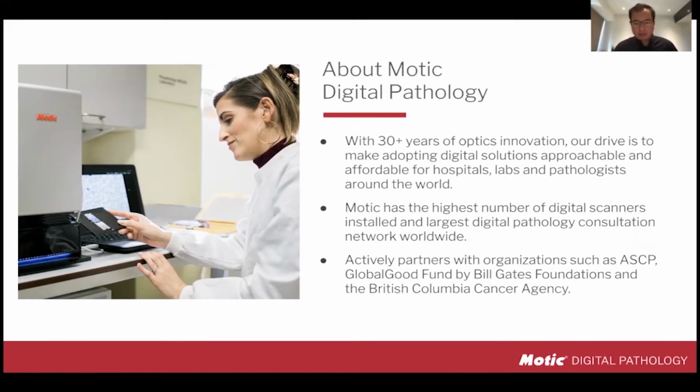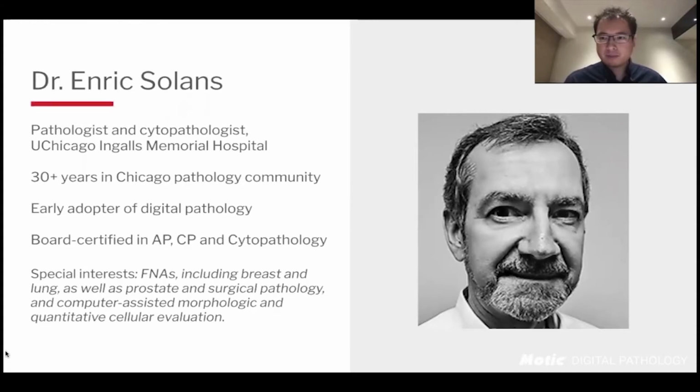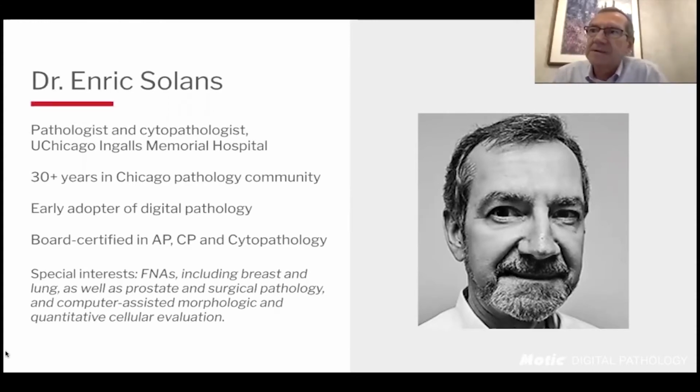With that, I think I should turn it over to Dr. Solans so that he can give a quick introduction of himself, his background in digital pathology, and then we'll move on to the presentation today. Well, thank you, Nick. My name is Enric Solans.